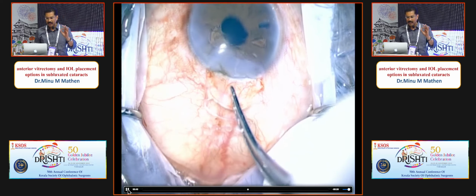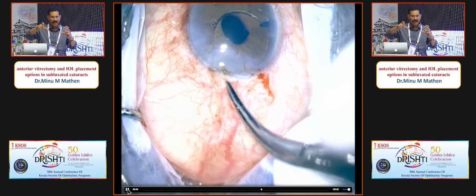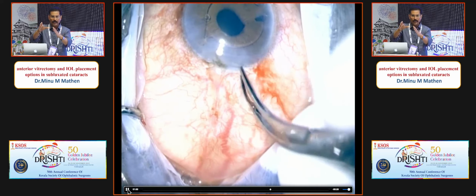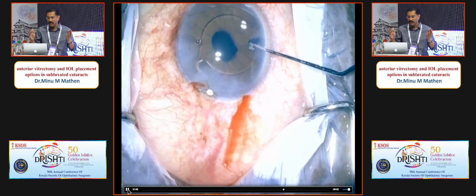And now we need to place it. If you think that you have 12 millimeters, and when you place horizontally, it is not feeling very tight. When you touch it, leave it, it is not springing back. It is just moving a little bit when you tap it. So then place it vertically. Vertically, you have a 0.5 millimeter advantage. So rotate it and place it.